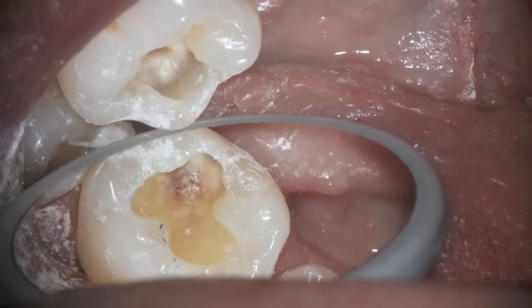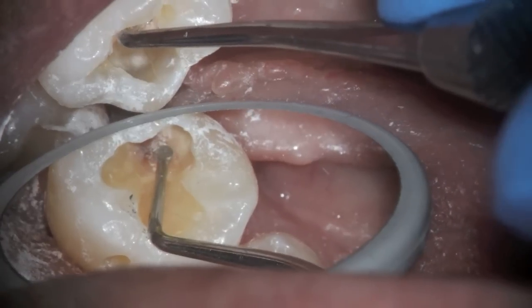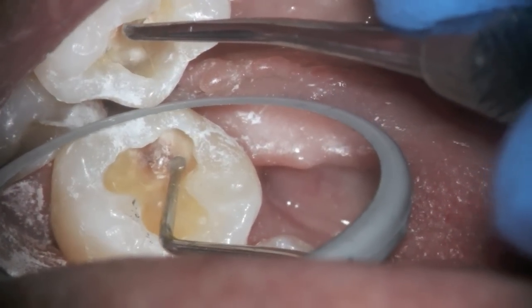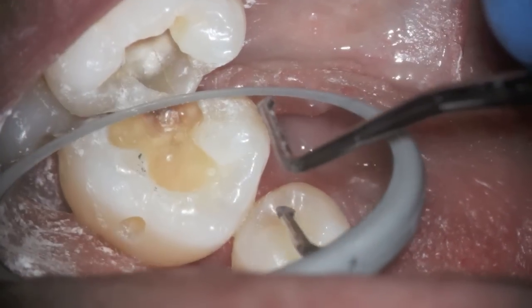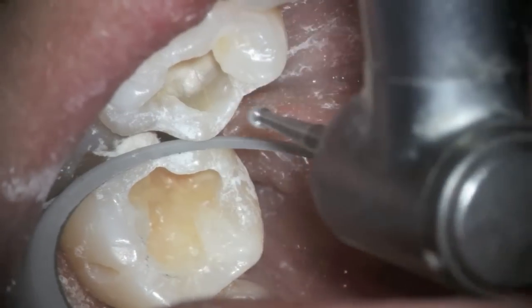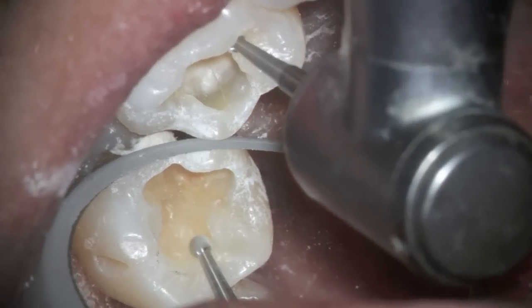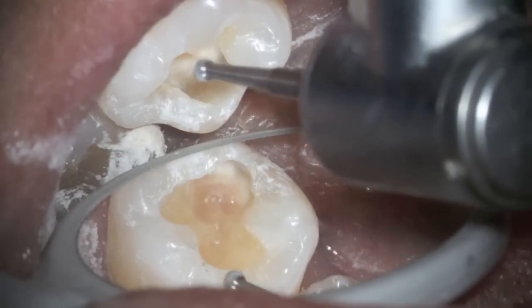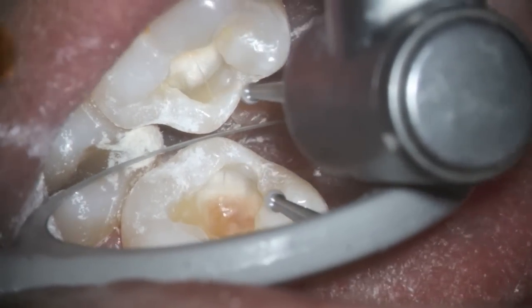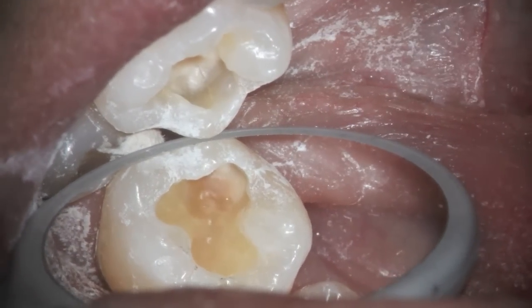Like I mentioned before, you can go back and look at the x-ray at the beginning. The tooth has two layers of composite: the original one where it was diagnosed that there was a problem, and then the dentist went in and wasn't able to see. I'm also using a mirror to help me see down inside the tooth as I do the drilling, because you really can't see the mesial angle there very well without using a mirror.